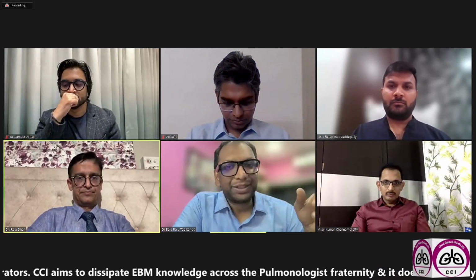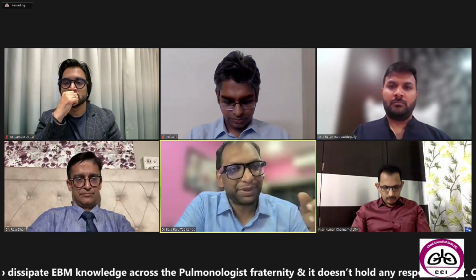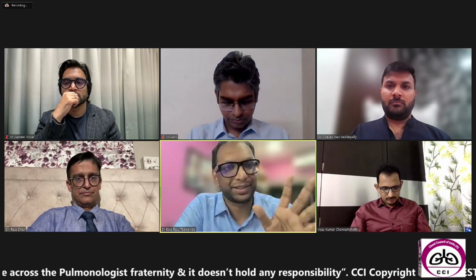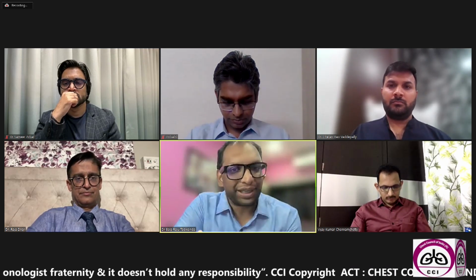But whereas cryo, right now you will never do in a conscious sedation, and that too without a balloon. So now you are more prepared for any eventuality, let it be a small bleeding or anything, because you are doing almost 99% of your cases under general anesthesia. So there is a balloon there. So there is an anesthesia and you have an airway secured.